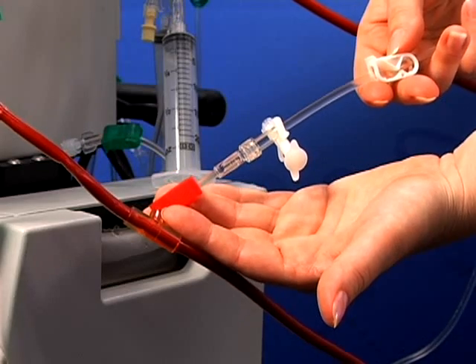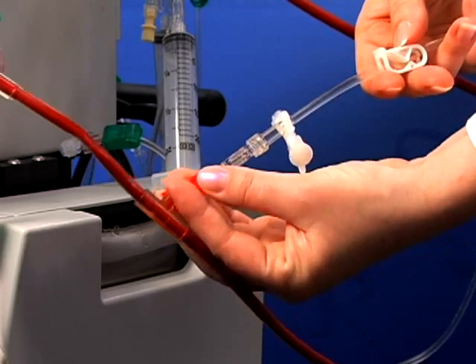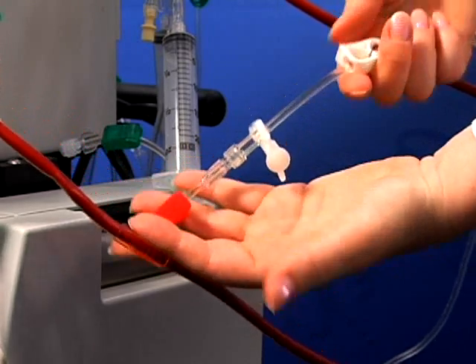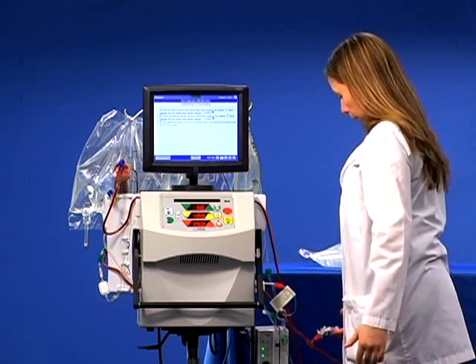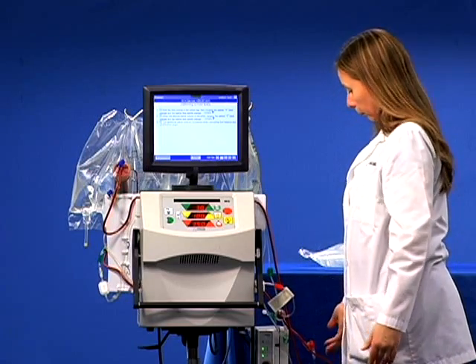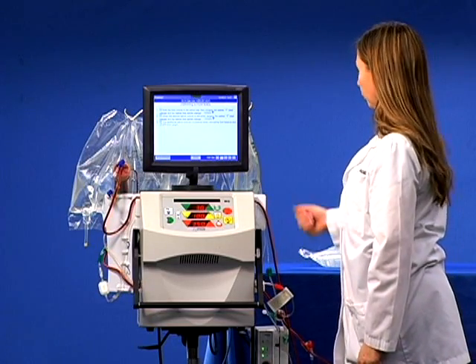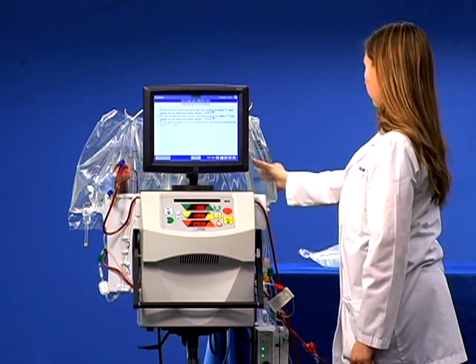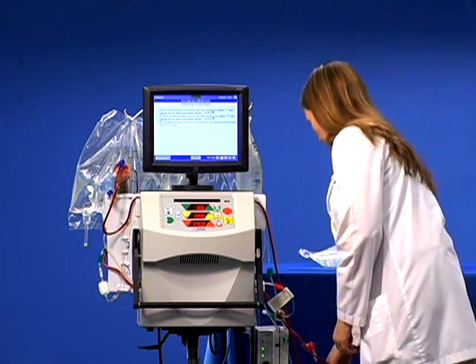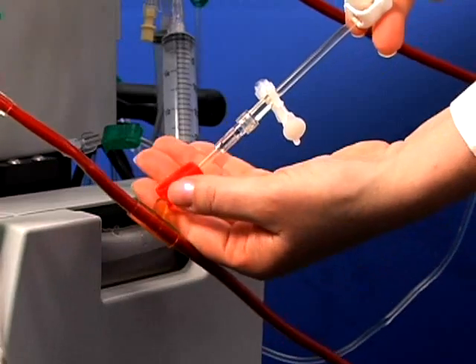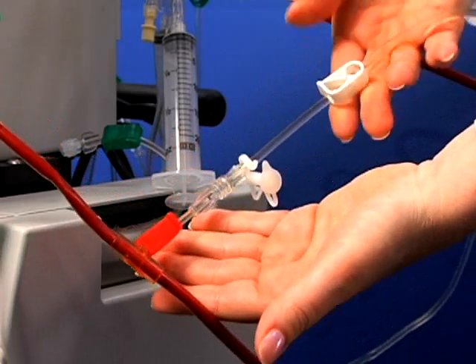Then unclamp the saline T and the saline line. When the desired saline volume is delivered, reclamp the saline T and the saline line.